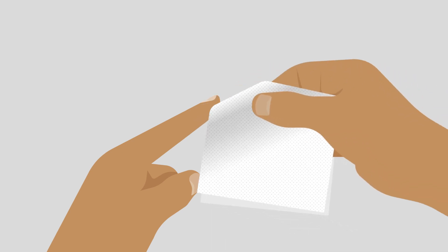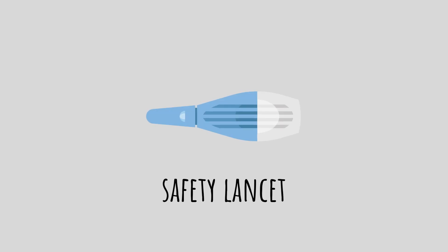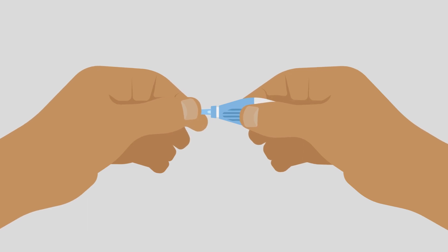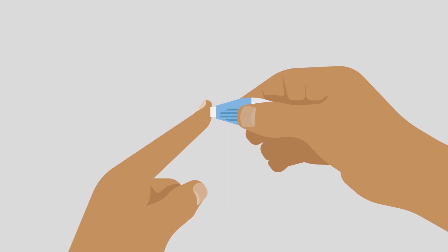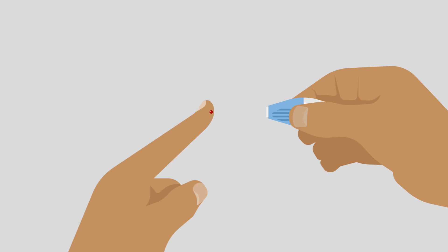Dry your finger with a clean tissue, as this helps the blood to form a droplet. To prick your finger, take the safety lancet and twist open the top end. Press it hard against the side tip of your index finger to release the internal needle. You'll feel a slight scratch. Put the lancet down.